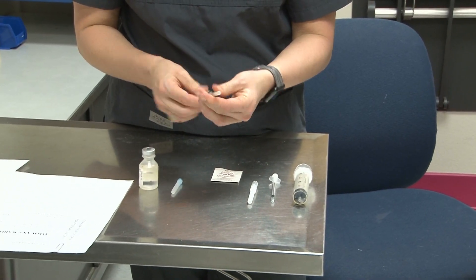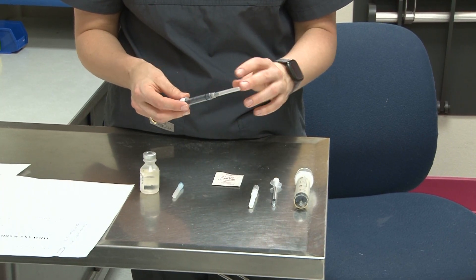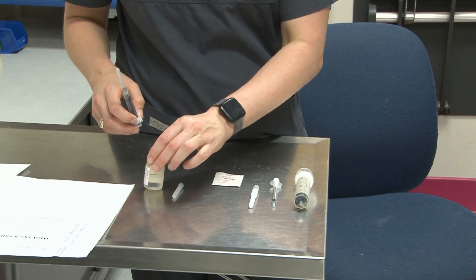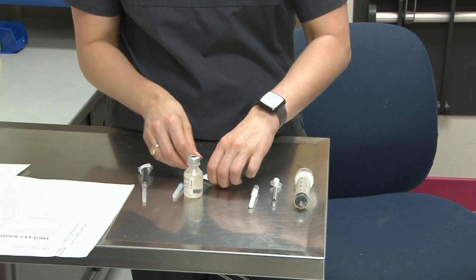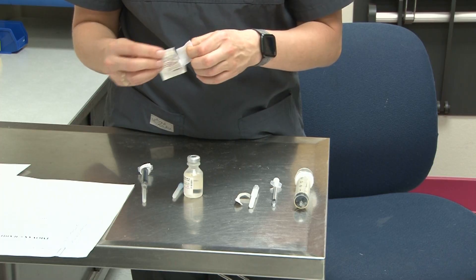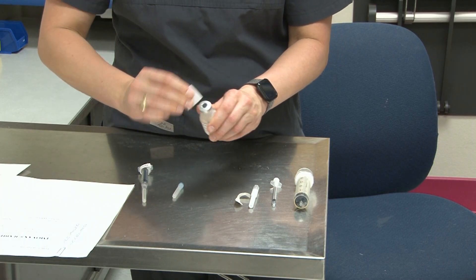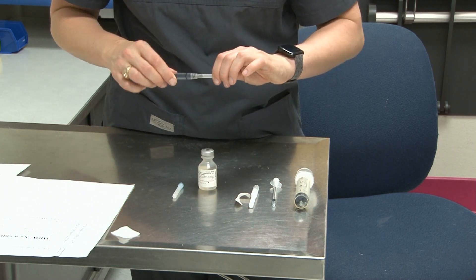You're going to put the needle on and twist it until it locks in, since this is a luer lock syringe. Then we're going to prep the vial by using a prep pad to clean it off, just to make sure there's nothing on the top. Then uncap your needle.